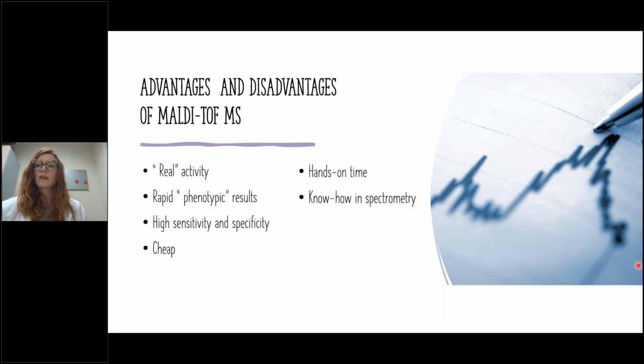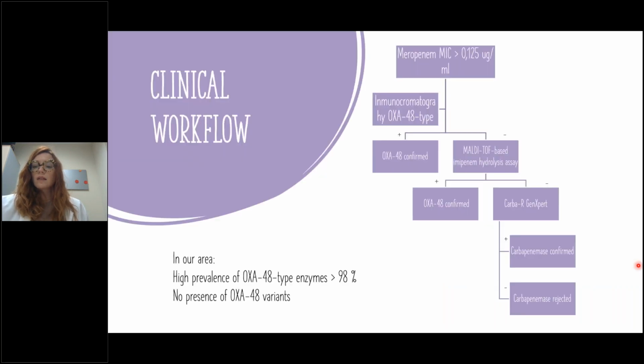It is true that it also has disadvantages, like the hands-on time, which usually takes more time to perform a MALDI assay, and it requires certain knowledge in spectrometry, especially at the beginning when you set up and standardize the assay. In our laboratory, we use all techniques really, because I think no one can replace another, so they are all complementary techniques.